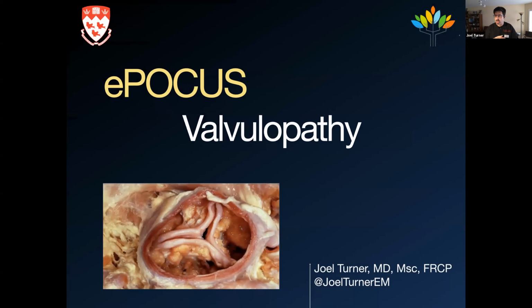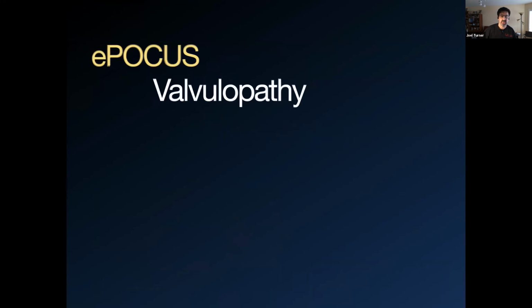Okay, so welcome everybody to the next section or lecture on advanced cardiac. This is one that I gave a couple years ago, and I think it continues to prove very important in terms of a skill that I think people need to start using, other than the usual LV function and that sort of thing.